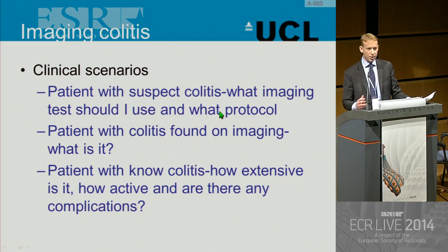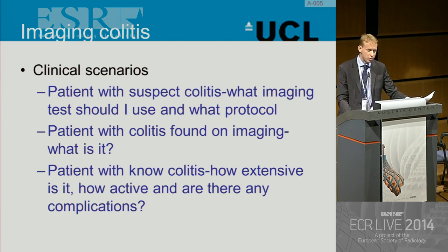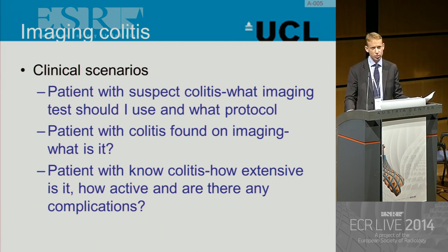When I think of the topic that we're going to talk about, three questions come into my mind. As radiologists, we're given a patient with suspected colitis, and the gastroenterologist or surgeon asks us what imaging test we would do, and then how we would actually do that test.